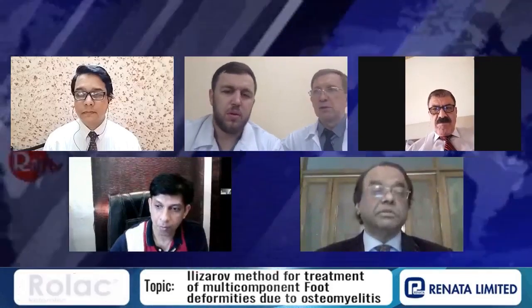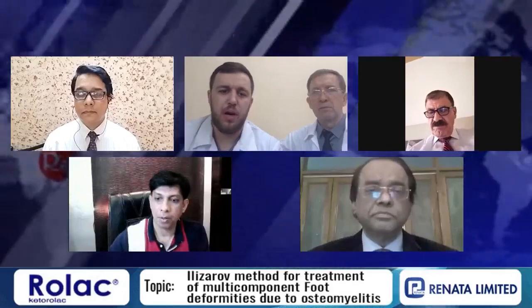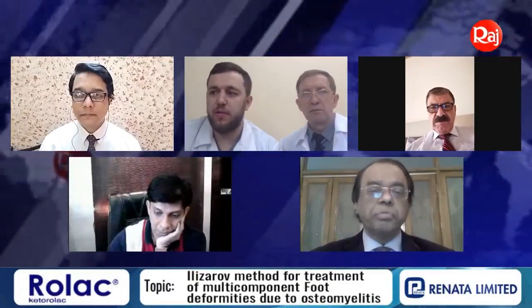Okay? Yeah, I think it is much better if we wait 5 or 7 days. It's much better for soft tissue after surgery. We know that in the first 5 days, soft tissue has some post-traumatic, post-operative infection, so it's much better if we wait some 5 or 7 days. I think this depends on the patient.